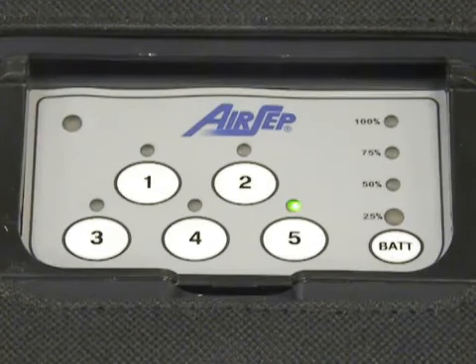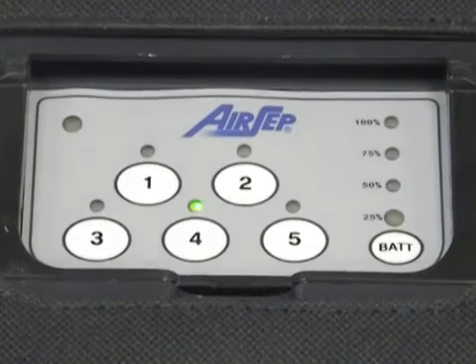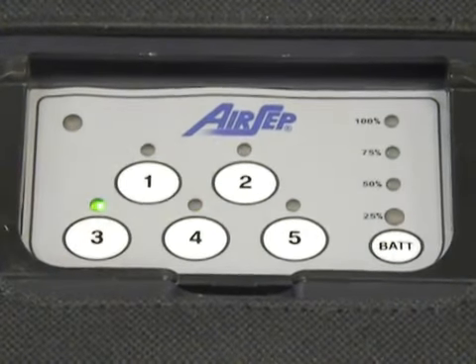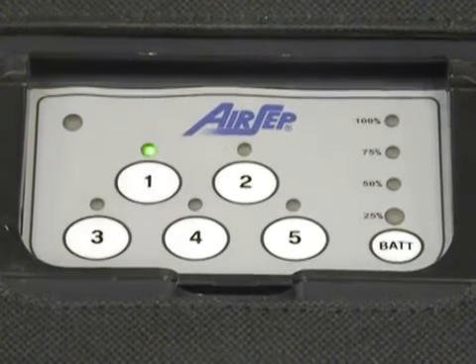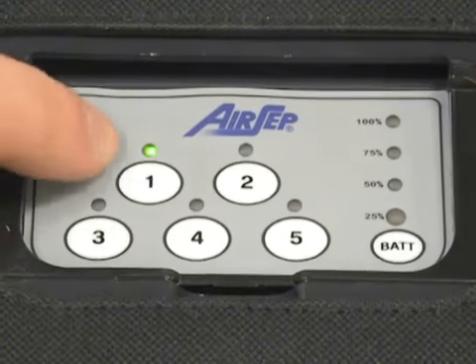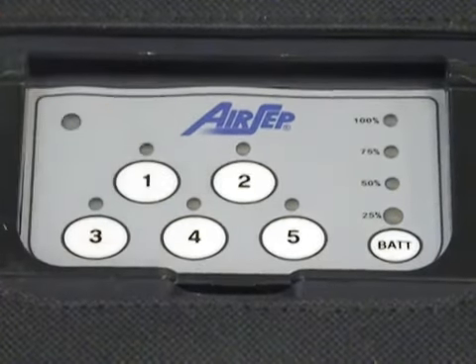If you want to enter other settings, you can press other buttons, such as 4, 3, 2, or 1. To exit test mode, simply press the button that has the LED lit. This will shut the unit off.